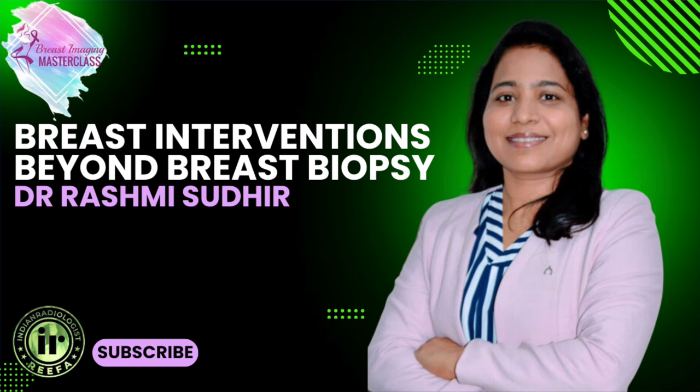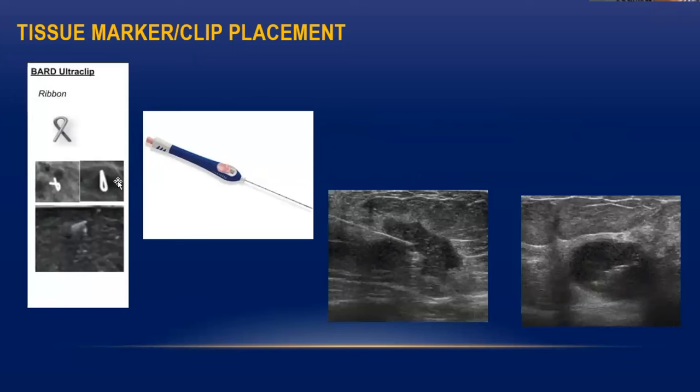The next investigation is the tissue marker placement. What we place here is an ultra clip — this is the ribbon shape which is easily available. This clip is inserted within this pen-like needle, and it is inbuilt inside the needle tip. There is a push button on the device.